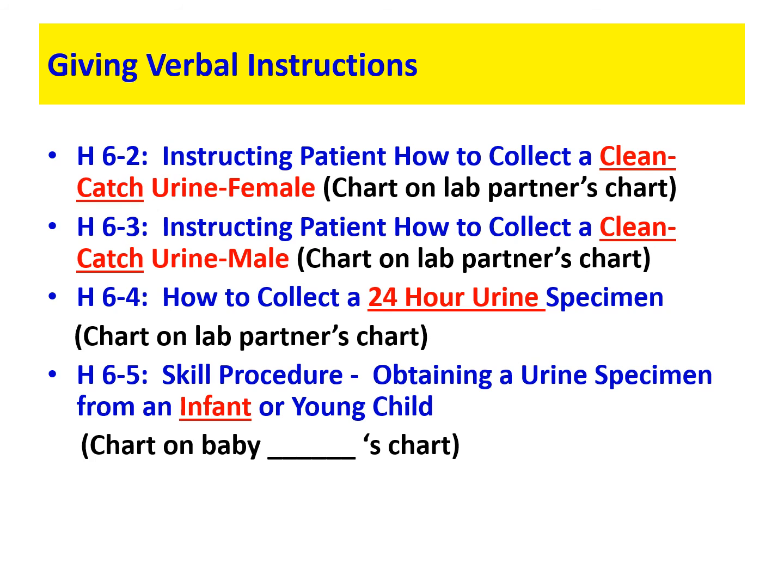Same thing, guys. We always make sure we have our hands washed and we're wearing our appropriate PPE. We always make sure the area we're dealing with our patients in is well cleaned between each patient, at the beginning of each day of our shift, and the end of each shift. We always want to make sure our area is organized and stocked and we have all the supplies we need at our fingertips, right? We always want to make sure we introduce ourselves, ID, and do a medical interview of our patient. Okay, so go through that on page 75 and put your initials there instead of your lab partner's, so that you read through that and you understand the steps that you must perform.